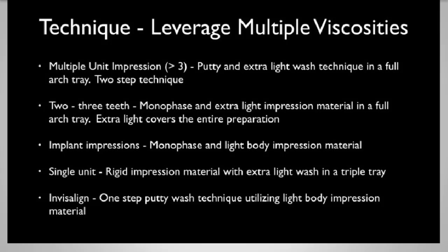Let that set. Once that's set and I have the proper amount of room around my preparations, I then go ahead and introduce an extra light body wash material onto the dentition as well as into the putty wash tray, and I go ahead and seat it. The benefit of that is I get some compression force from impression material into the multiple preparations.